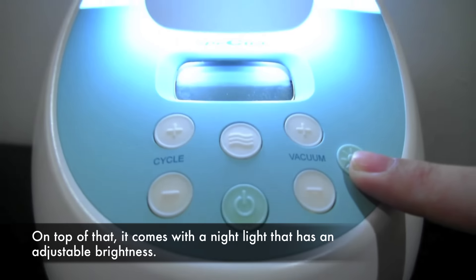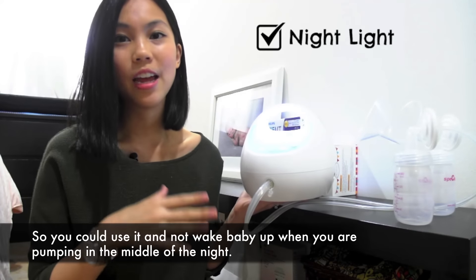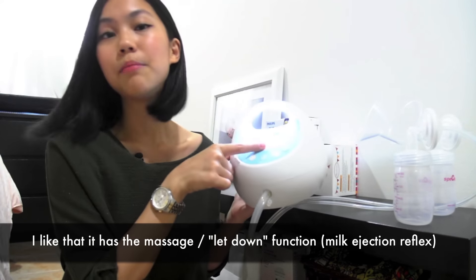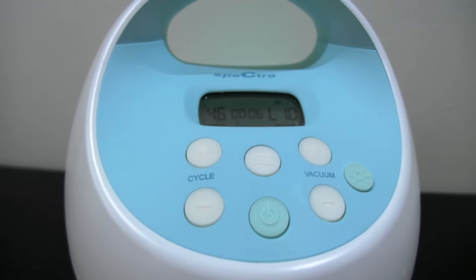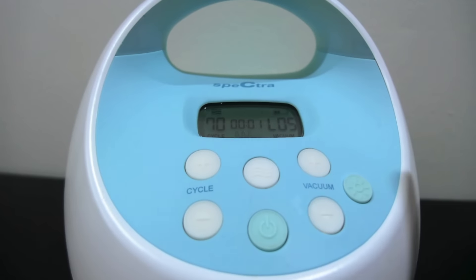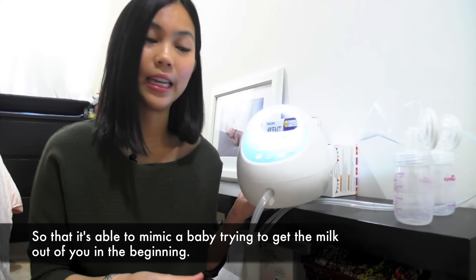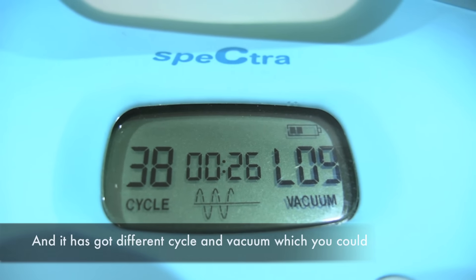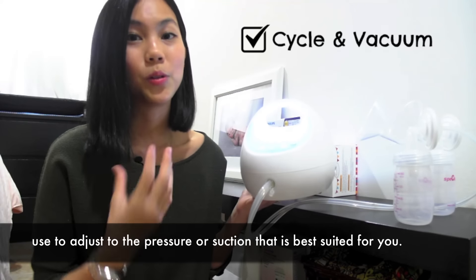It comes with a nightlight that has an adjustable brightness so you can use it and not wake baby up when you're pumping in the middle of the night. I like that it has the massage function or the letdown function, so that it's able to mimic a baby trying to get the milk out of you in the beginning. It has got different cycles and vacuum which you could adjust to the pressure or suction that is best suited for you.